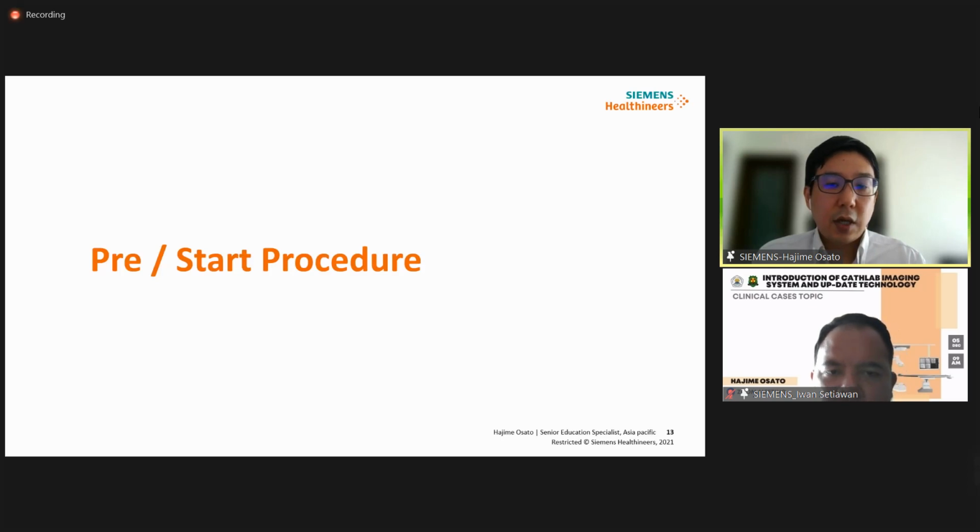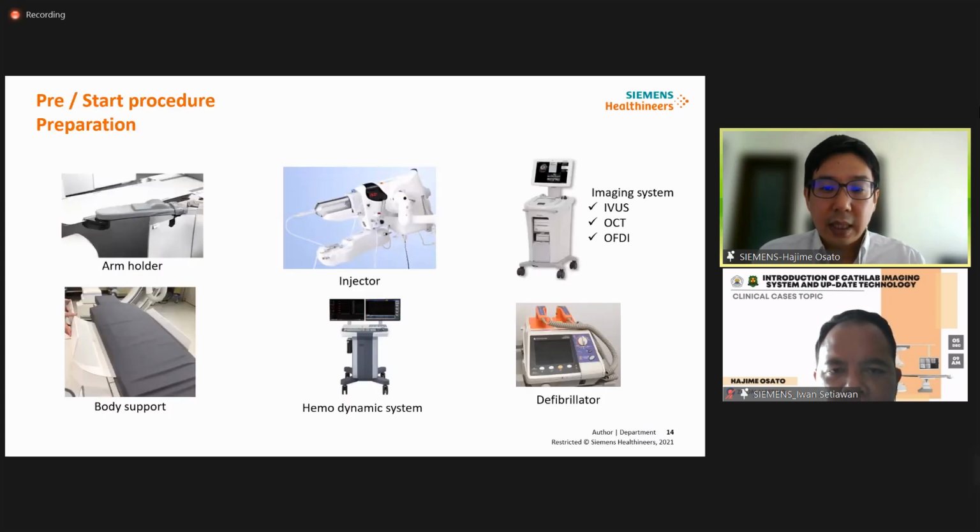All right, so go to the procedure step. The first topic is pre and start procedure. Firstly, please confirm the puncture site.